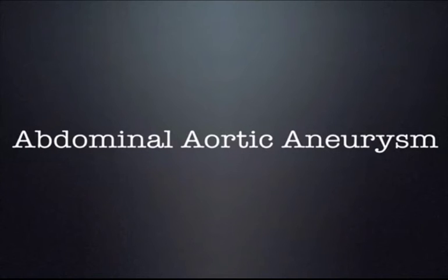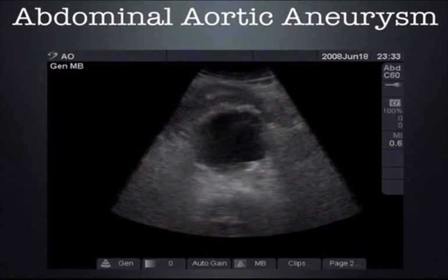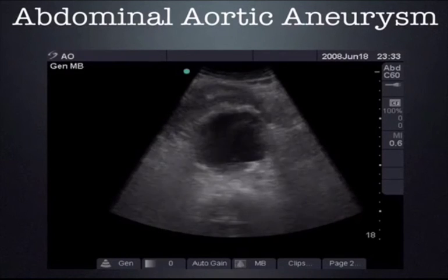Okay, now we're going to look at some actual ultrasound video clips and images of abdominal aortic aneurysms. Now this image here is kind of interesting. You can see here clearly the abdominal aortic aneurysm. Here is the underlying anterior cortex of the vertebral body. But watch as I start the video, the aortic aneurysm disappears into the bowel gas. So you can see here a key point is illustrated.